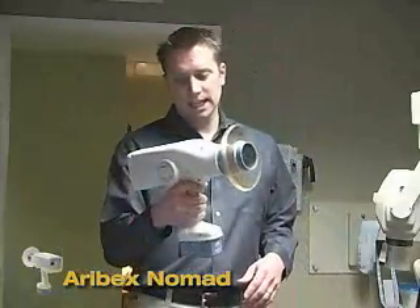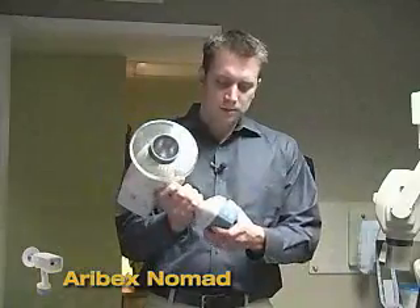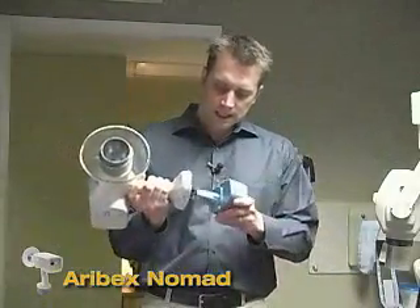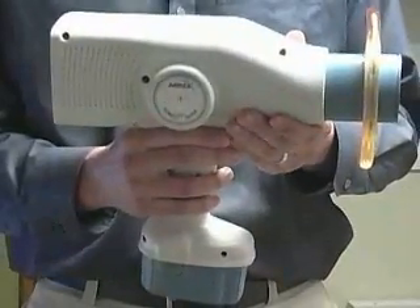The traditional use of these swing arm x-ray generators has actually changed now with new technology from Aribex. It's called the Nomad and it's actually a portable x-ray generator. It fits in the palm of your hand, operates with an 18 volt battery and delivers 60 kVp of true DC power. The Nomad unit weighs only 8 pounds.